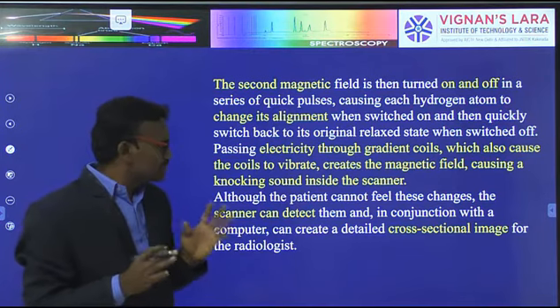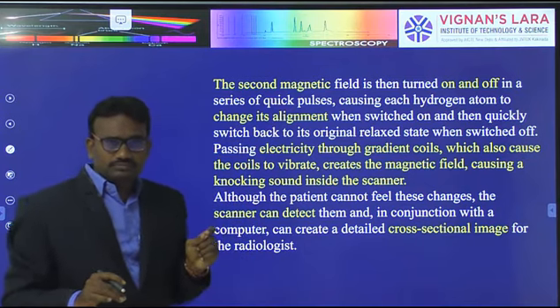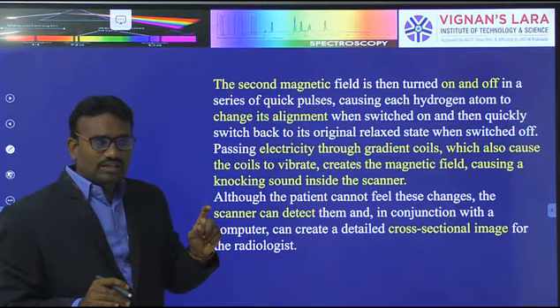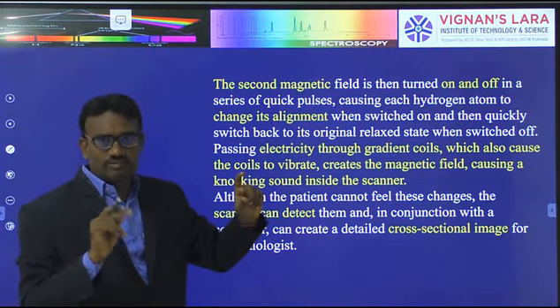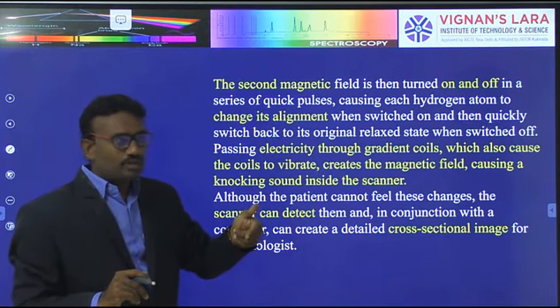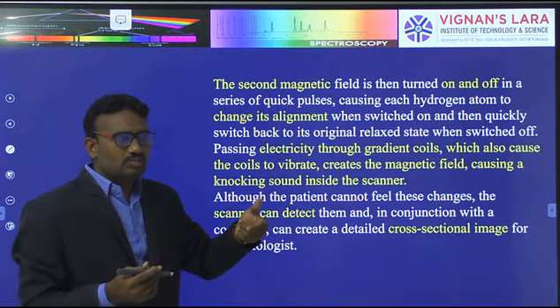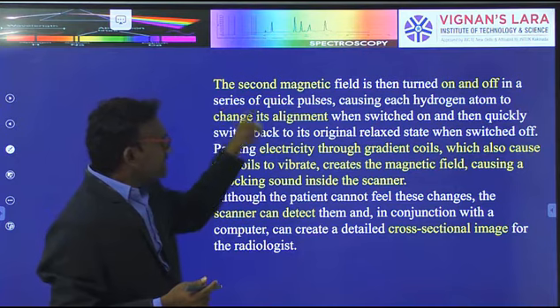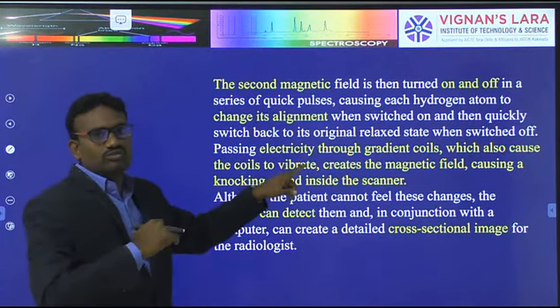That means, simply, the hydrogen atoms are in the same positions set by the first magnet. Based on the second magnet, the position is changed. If all positions are on the north side, then in the second magnet's on time the position is changed to the south side.